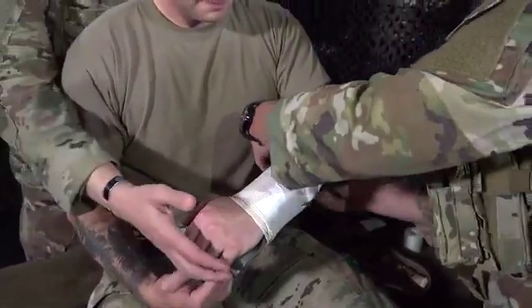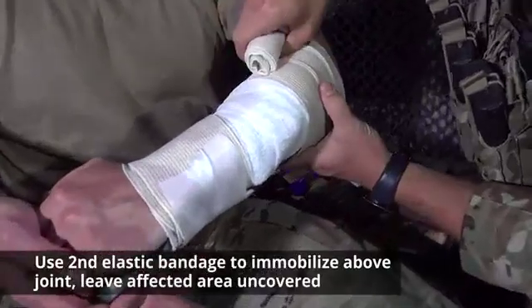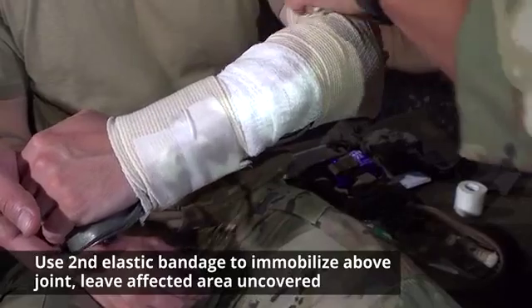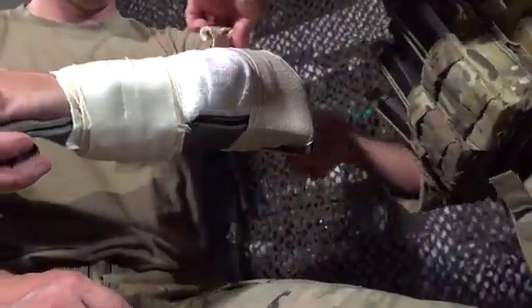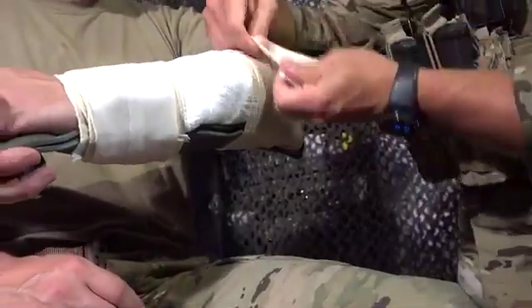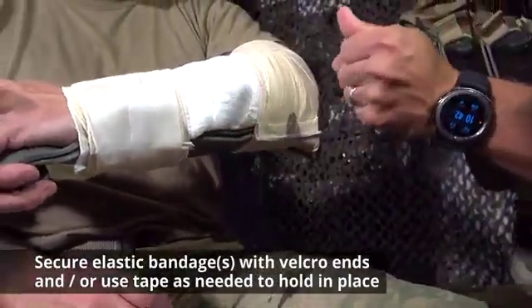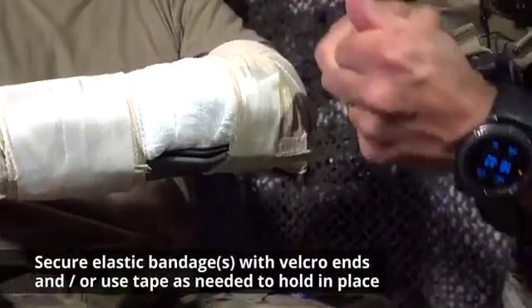For our second elastic bandage, we'll start here — immobilizing the wrist initially — then go around and immobilize the elbow. We'll flip it to make sure it ends up on the right side, use the velcro, and then again secure it with tape for an extra level of security.